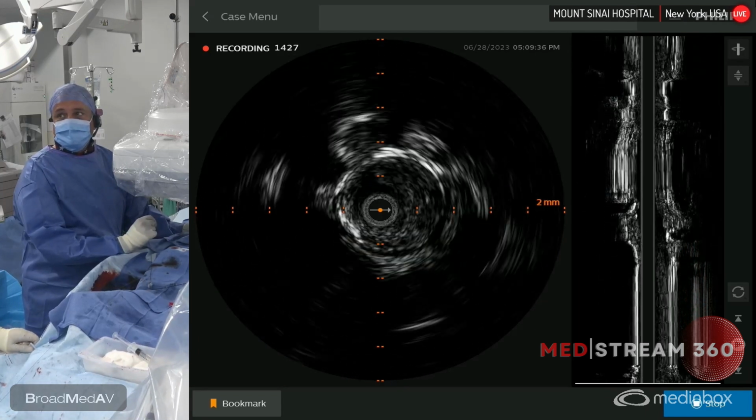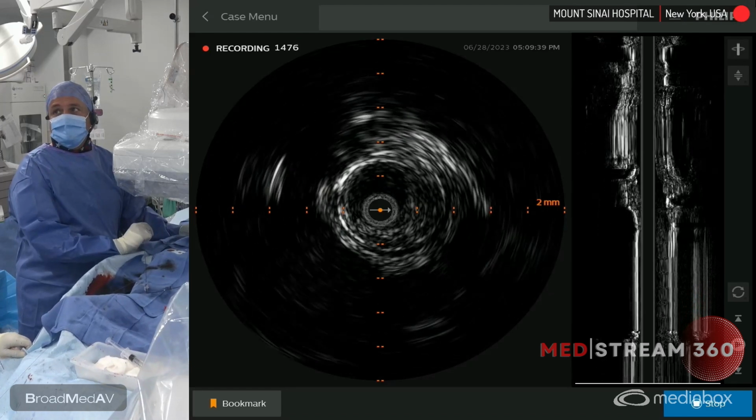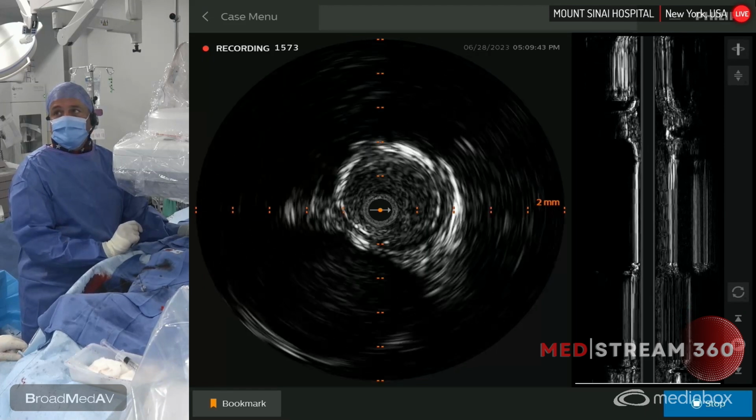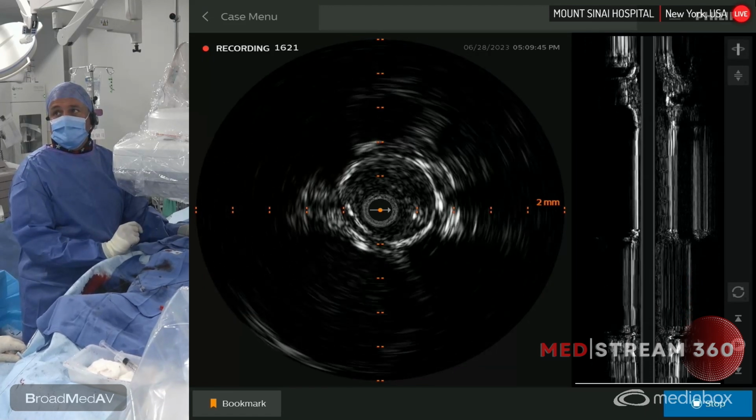And that's part of the reason why the embolization occurs. You can see it there, and that's part of the reason. You can see the long segment. Look at that. Look at the level of speckled thrombus there.